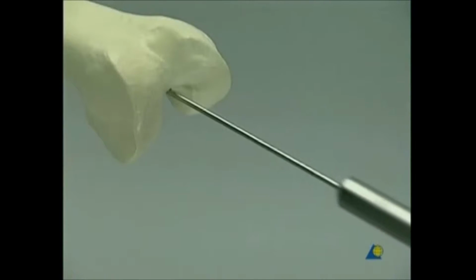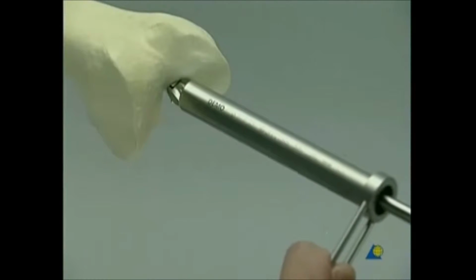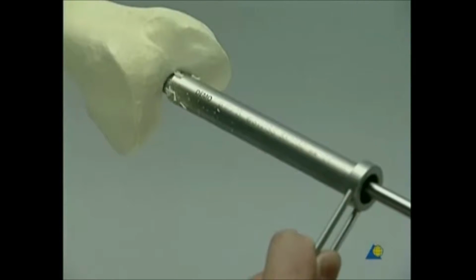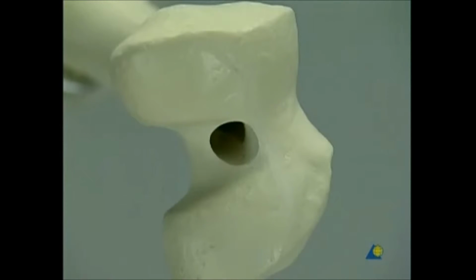To open the medullary canal, the protection sleeve and drill sleeve are pushed over the guide wire onto the notch, and with the drill bit, the medullary canal is opened to a depth of approximately 30 millimeters. The drill bit, protection sleeve, and guide wire are then removed. The knee joint is carefully rinsed to remove all drilling debris.